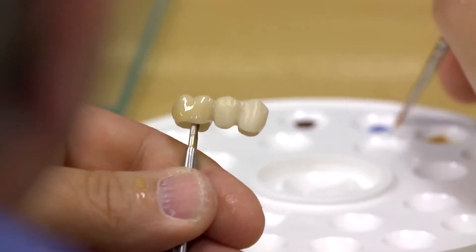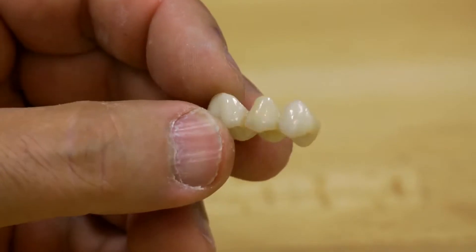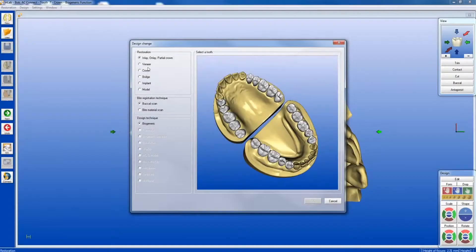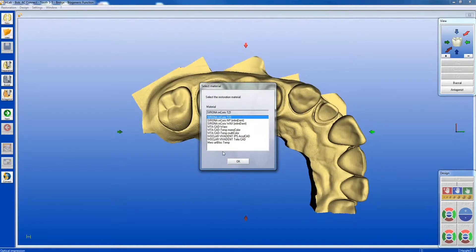You can start your case with an acquisition from your inEos Blue scanner or a digital impression received from Sirona Connect. Under Restoration, choose Bridge Mode. This mode is required to maintain adequate minimal thickness as prescribed by this product. Under Select Material, choose Sirona inCoris TZI. Click OK.